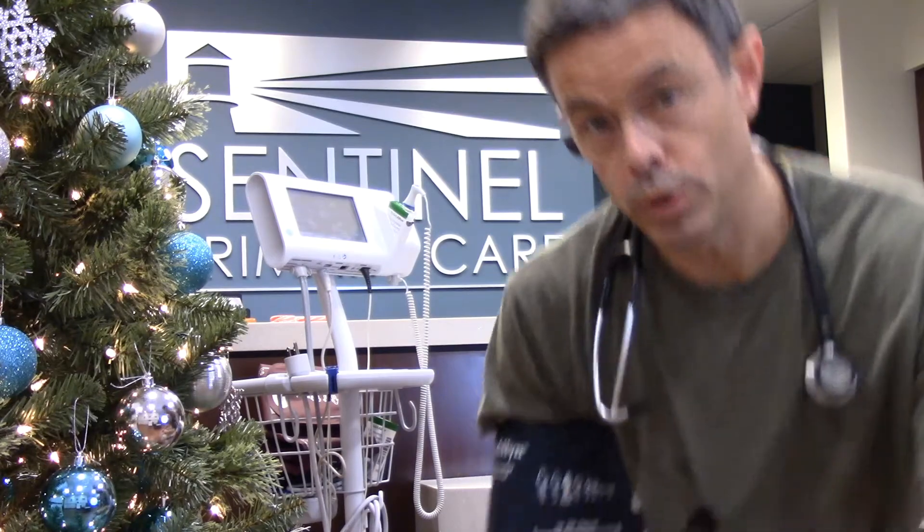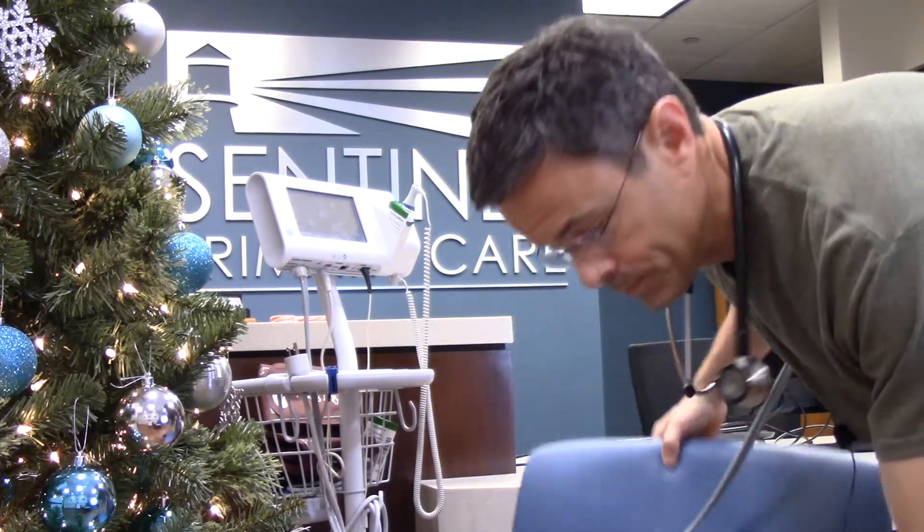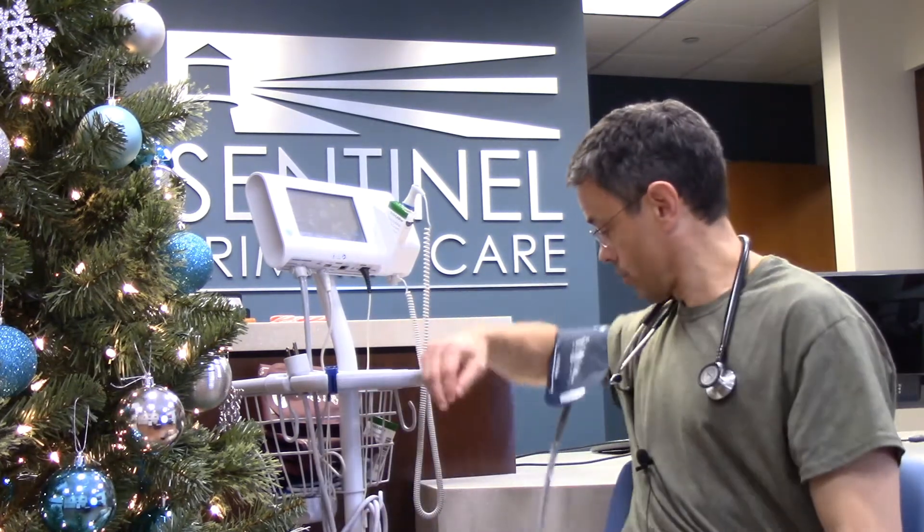Number three: positioning matters. You want a chair with back support rather than lying down or sinking into a squishy sofa. Sit and lean back into the back support, feet flat on the floor, and your arm should rest comfortably at tabletop height — or at armrest height if your chair has one.